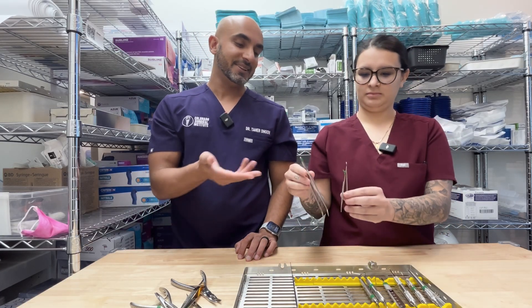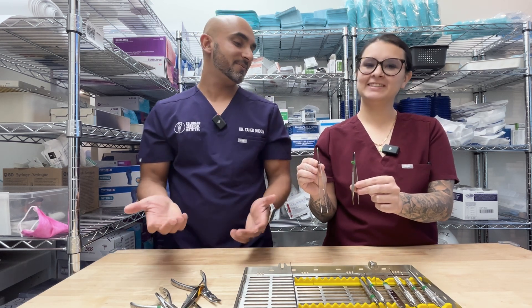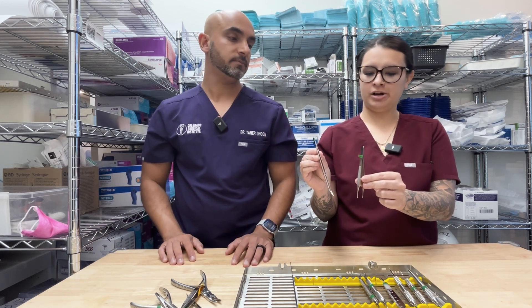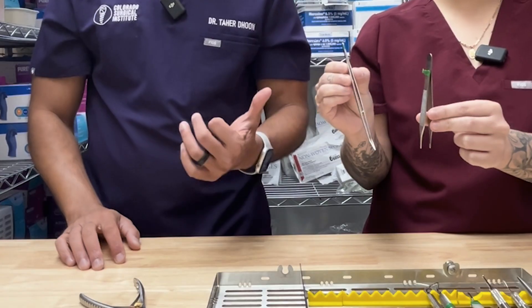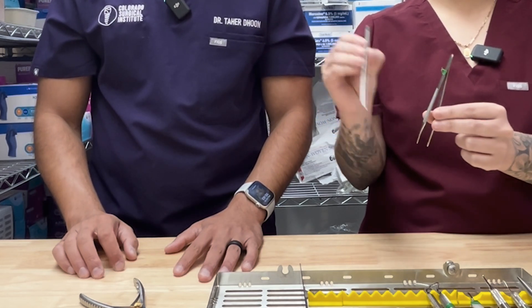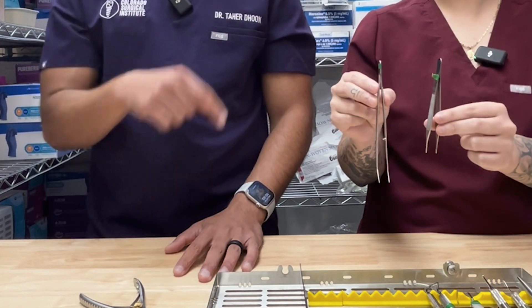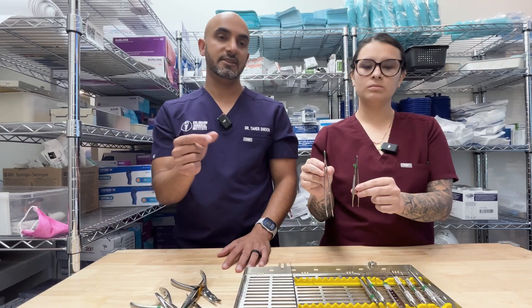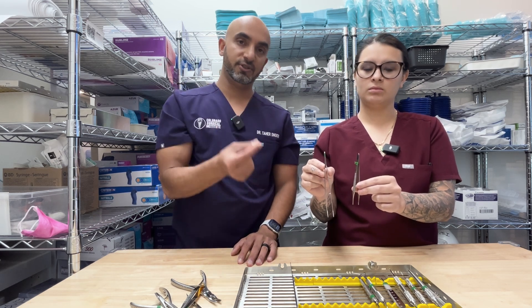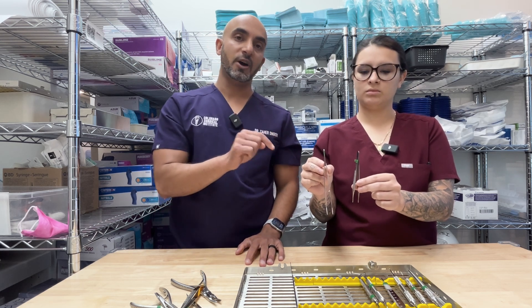These are college pliers, or cotton pliers. I mainly use them to grab PRF. As an assistant, I'll help suture with them — I grab the end of the suture that he's going to go grab with his needle driver, feeding it to him so he goes quicker. That's a huge pro tip: if your dental assistant can grab the tail of the suture when it's flapping around and pull it closer to you, you're going to suture about twice as fast. I also use this to approximate tissue — I'll grab the tissue with the Adson forceps and the cotton pliers together and try to re-approximate it to see where the passivity of the tissue is.